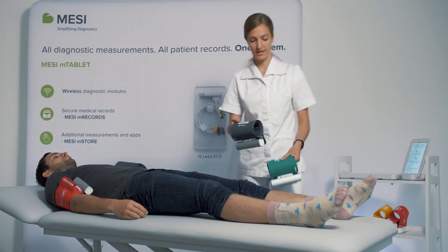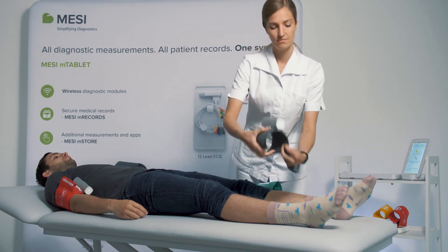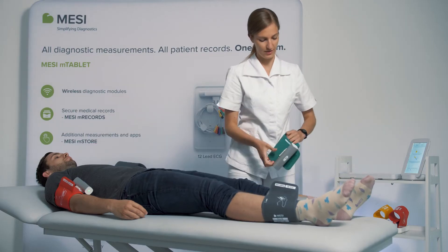You do the same with the leg cuffs, again making sure that the medial ankle arrow is pointed towards the inner ankle.